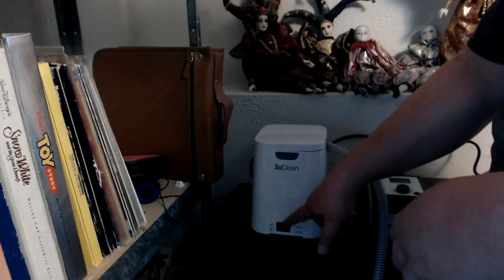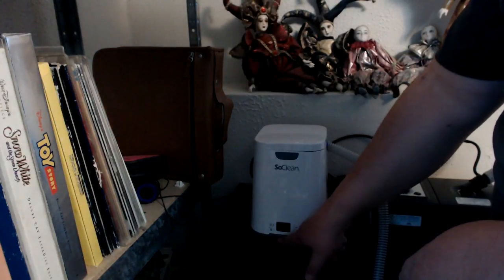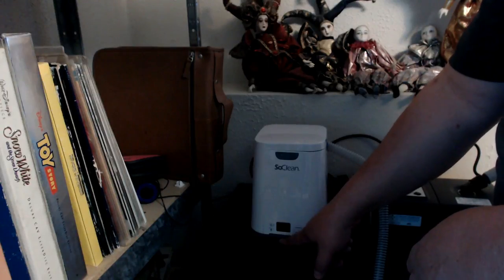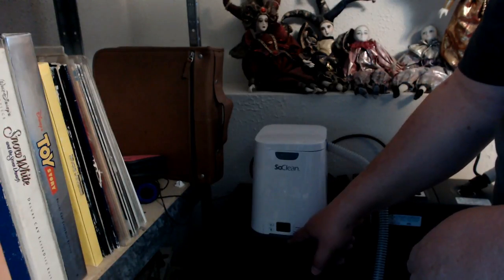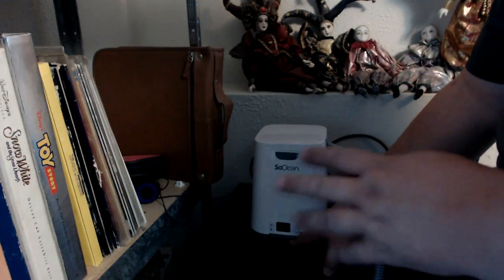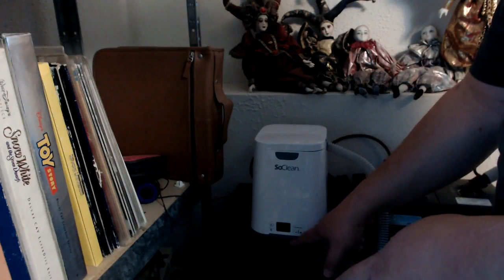When it's ready, it'll start up on its own and run. There's a little LED light on the bottom - it'll be red while it's going, then yellow afterwards. Then you leave it until it's green, which is probably a couple of hours afterwards. It's best to do it shortly after you wake up, just let it do its thing on its own.